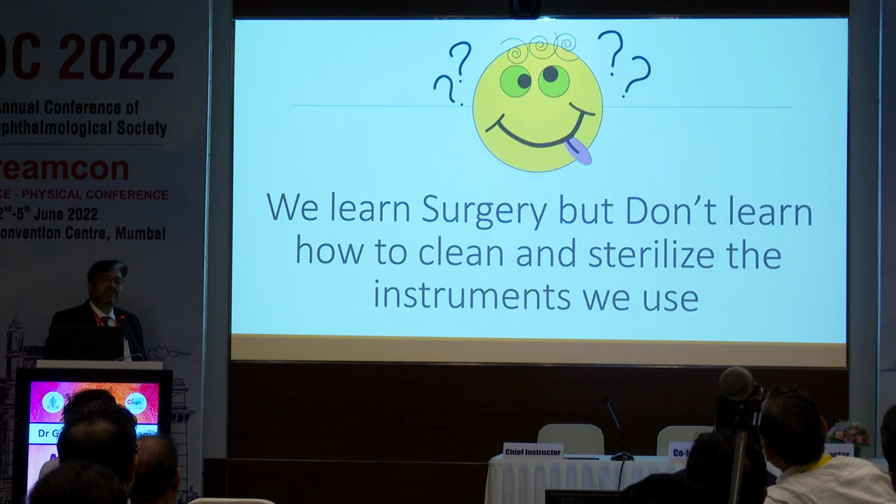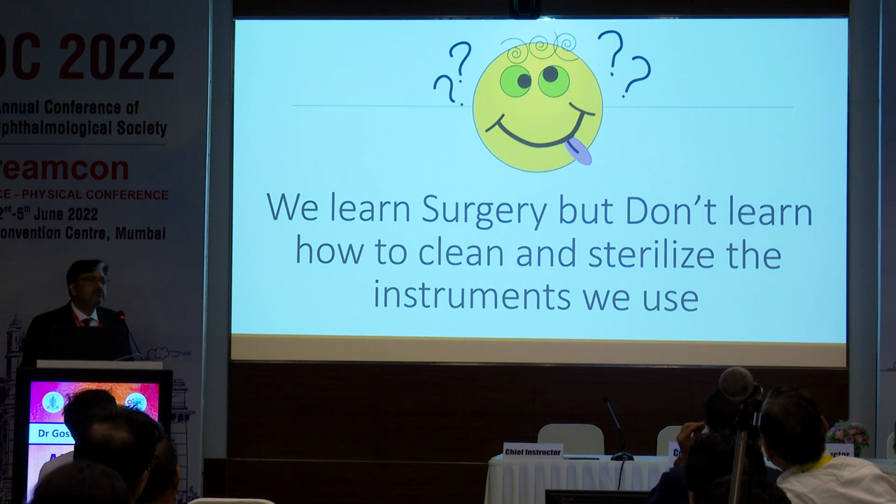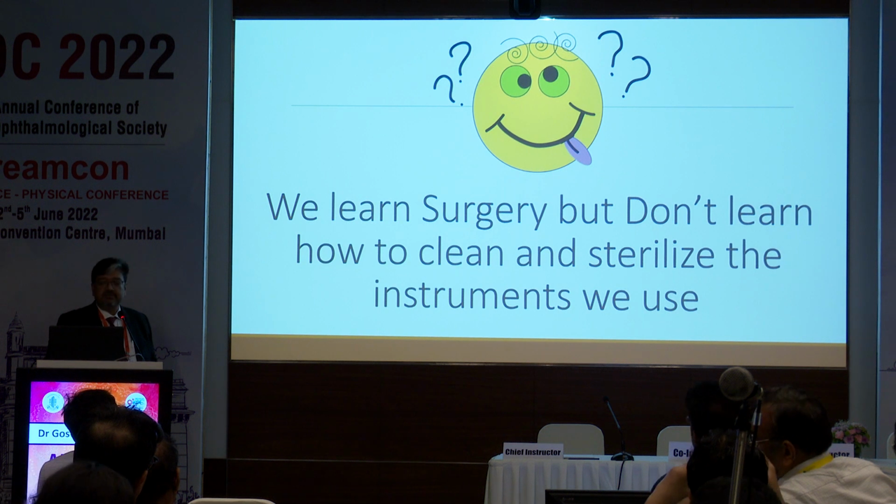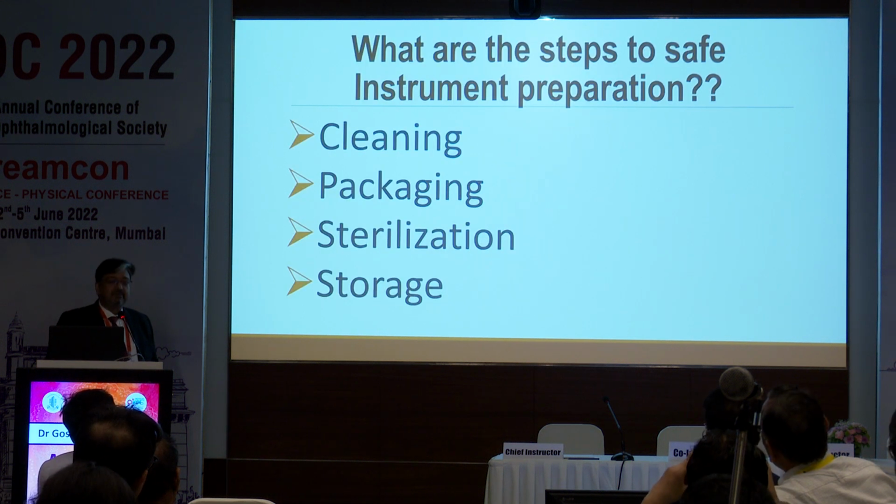So we learn, but don't learn how to clean and sterilize our instruments. So why do we really need to clean our instruments? You may just wonder, why not just straight away take the instruments, put them in the sterilizer, maybe an ETO or a steam sterilizer, and finish off with it. That doesn't happen like that, and I'll explain to you why.